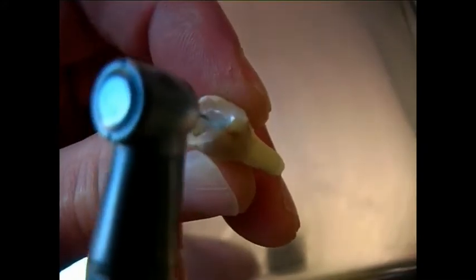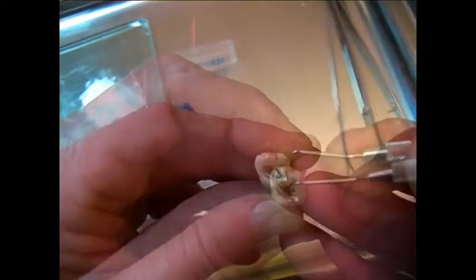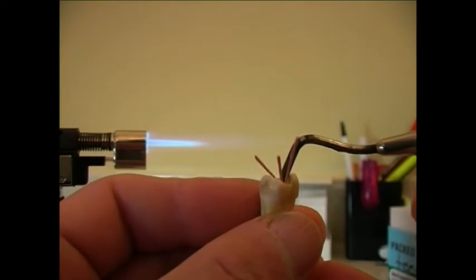Slow setting cements are spun down the canals. Gutta-percha points are inserted next. They're packed in tightly to try to completely seal the canal. Supposedly this will stop bacteria from getting into the tooth and reinfecting it.